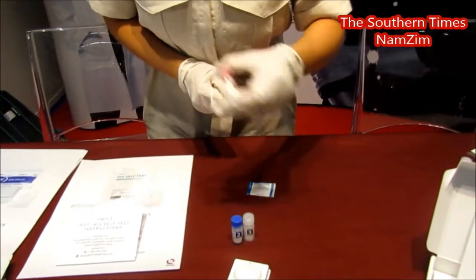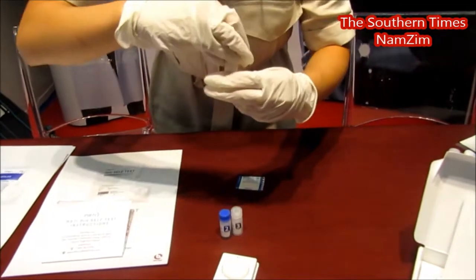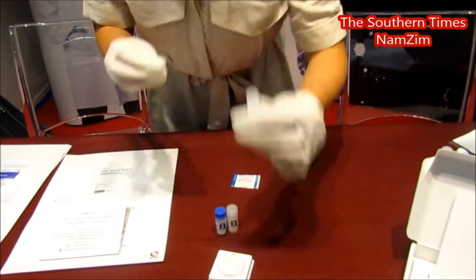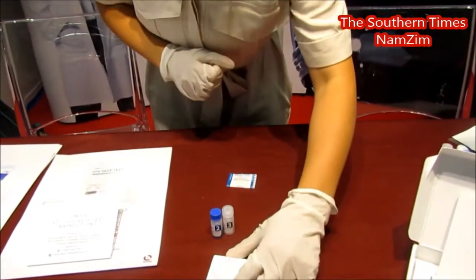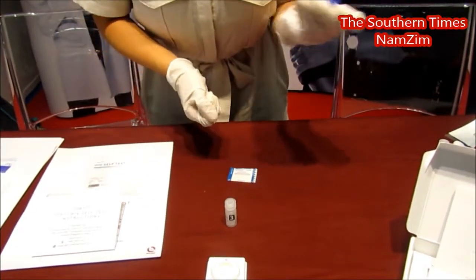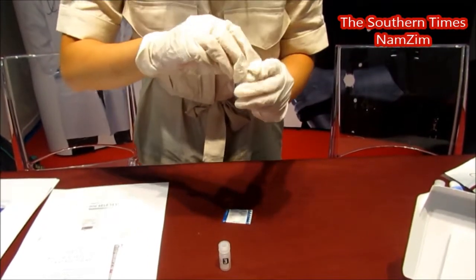And that's your sample diluent. So you just give that a little shake, and you pour that into the test device here. And then next, you're actually going to see that flow through. We're going to add your bottle two. What your bottle two does is it's a color developer with indigo.